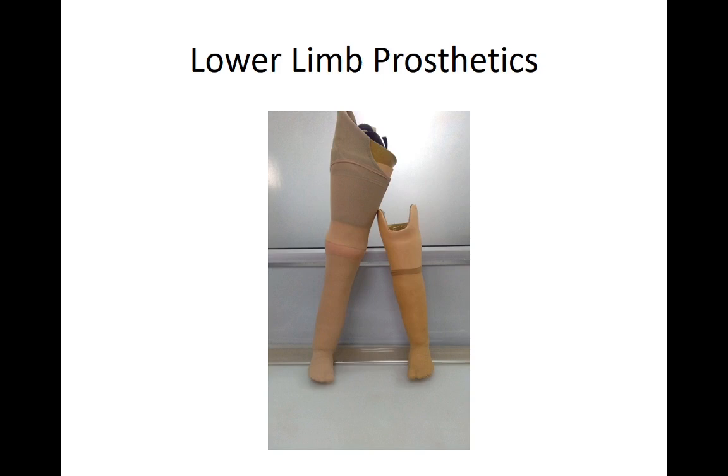Another important thing is that while using a prosthesis, the circumferential measurement or the volume of the stump will reduce. When a patient first comes, we take the casting and the measurement is different. After he uses the prosthesis for around 6 months, the measurement will reduce, because the fatty deposits are burnt up and the muscle contracts, so there will be a volume reduction.